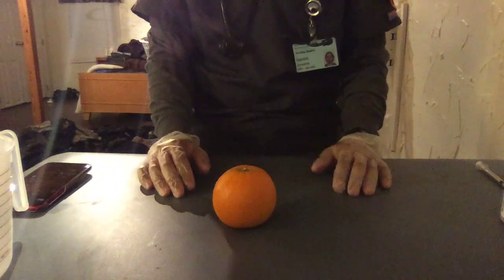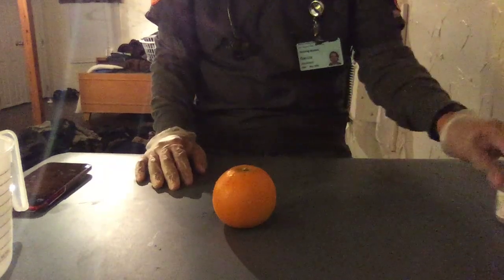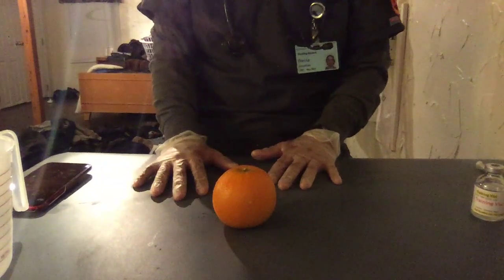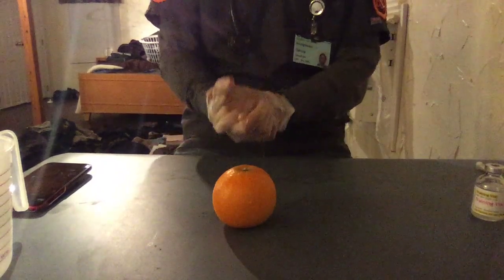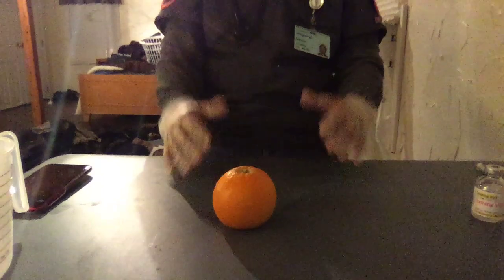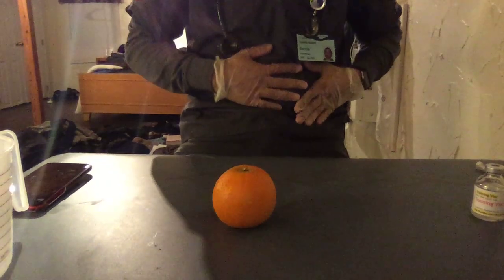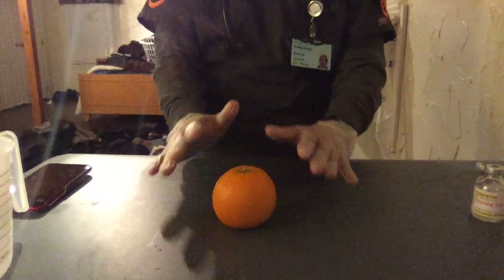Now the subq. Again, I did all the steps that I did before. I already have my medication. So now, Miss Smith, if I do it at the same time, if I do it another time, I will come and do the same thing, sanitize my hands, and then she will be in a supine position because I will give her the subq injection in her abdomen. So I sit her down.